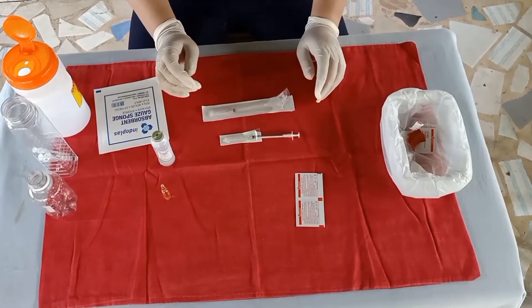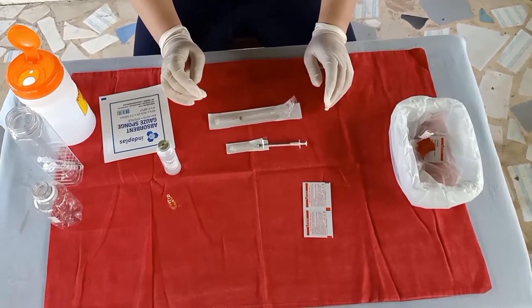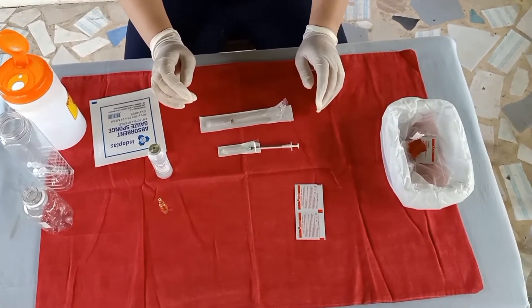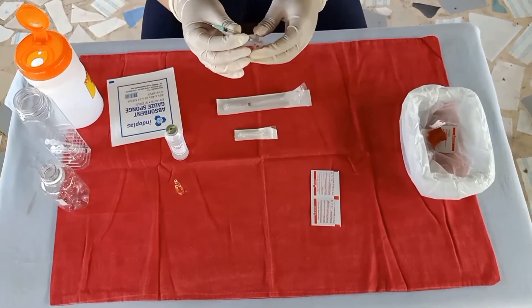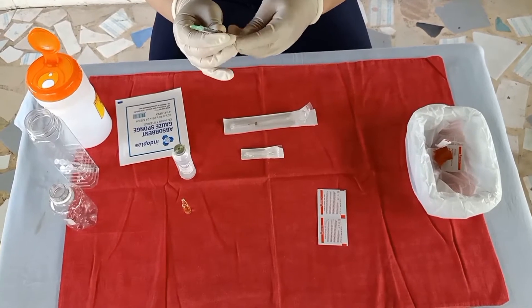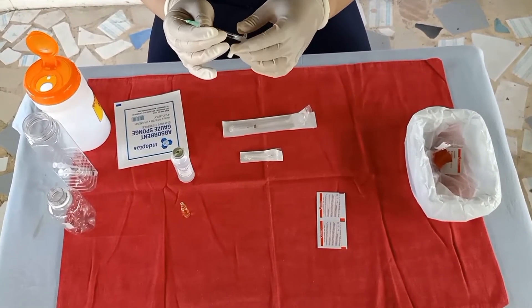Remove the cap from the needle, then draw up into the syringe the amount of air equal to the volume of the NSS to be withdrawn — 0.9 ml.